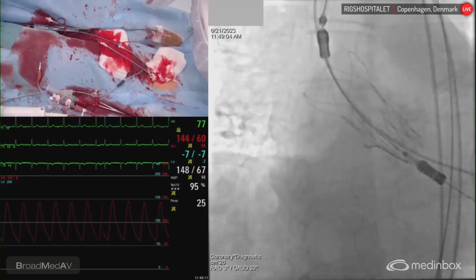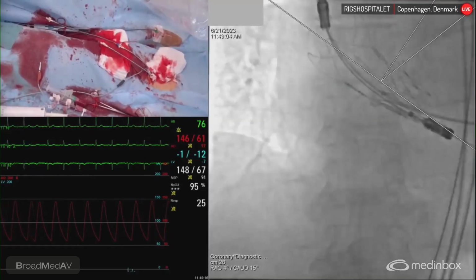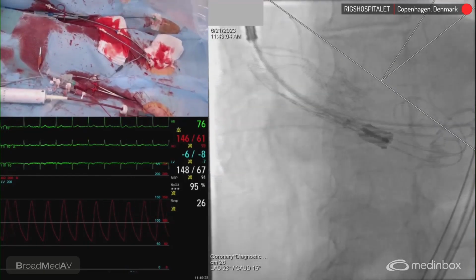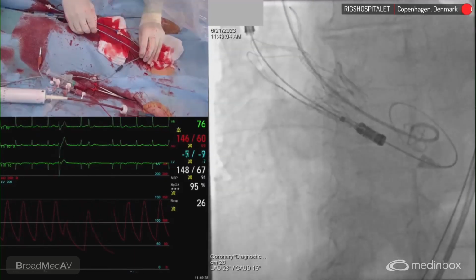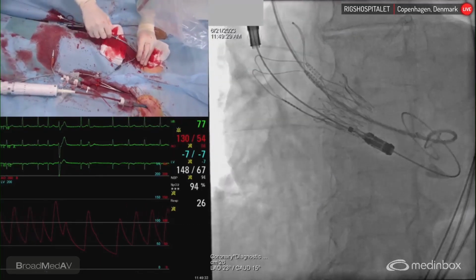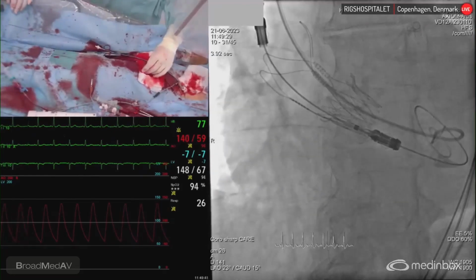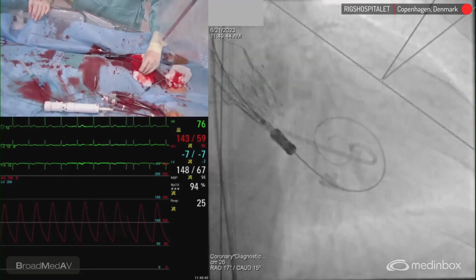But look, I can do it in the other angle, overlapping, but there I cannot push my catheter. The point is that it has to swing over both sides of the overlapping arches. Here I can document it. You see, here it's on the inside, and I can push it to the outside. Yeah, that's good. So it's for sure good. All right, good. So that's proof we have.